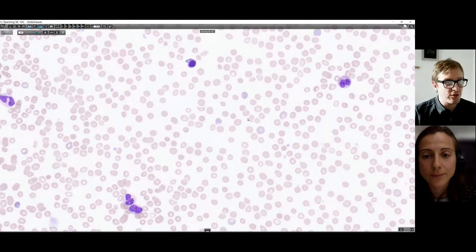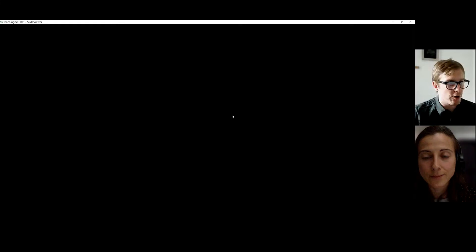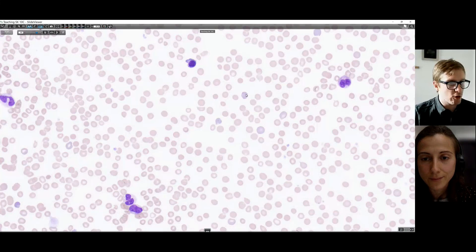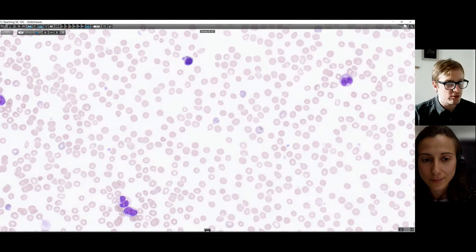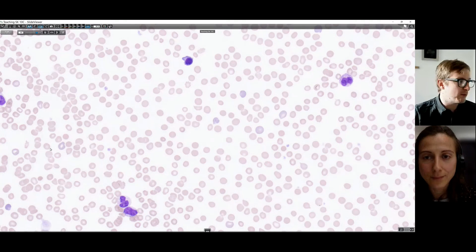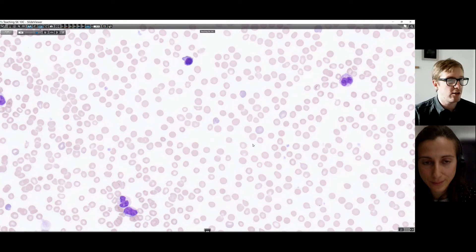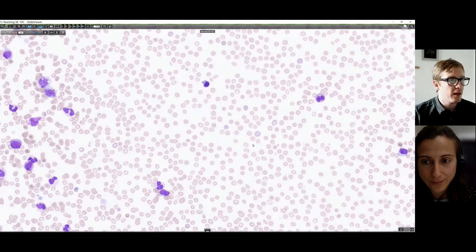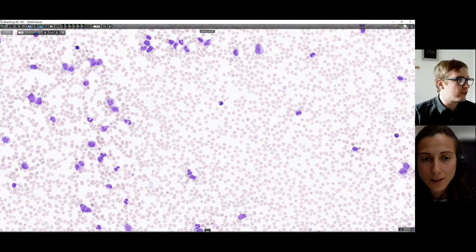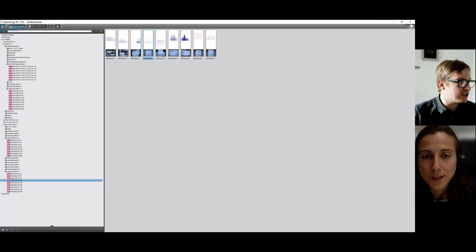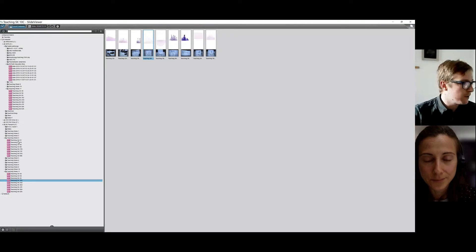There's another abnormal nucleated red cell. And also what we have seen is quite a lot of polychromasia - these purplish cells. I'm not going to labour on the red cell morphology, but there we are - lots of polychromasia along with those nucleated red cells. So that was case three. And now moving to the last case.